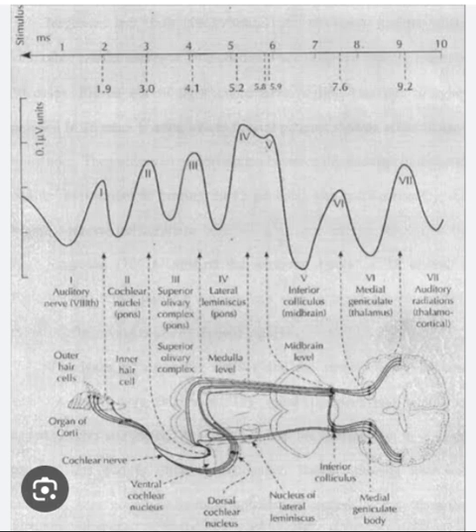Published by NCBI. Introduction. The Brainstem Auditory Evoked Response, BAER, test is an objective diagnostic tool that offers valuable insight into the integrity of the auditory pathway and, by extension, the health of the surrounding brainstem. It measures the action potentials generated in response to auditory stimuli from the cochlea to the auditory cortex.